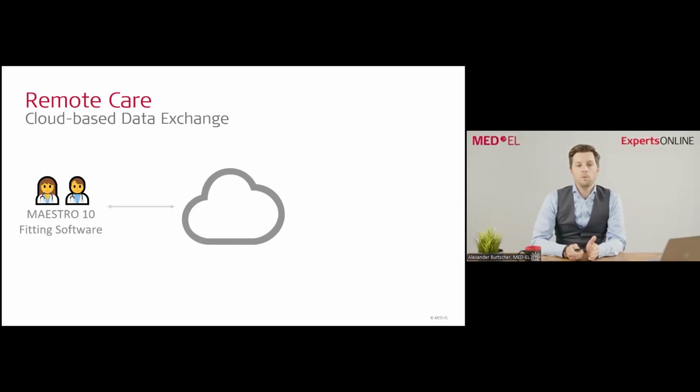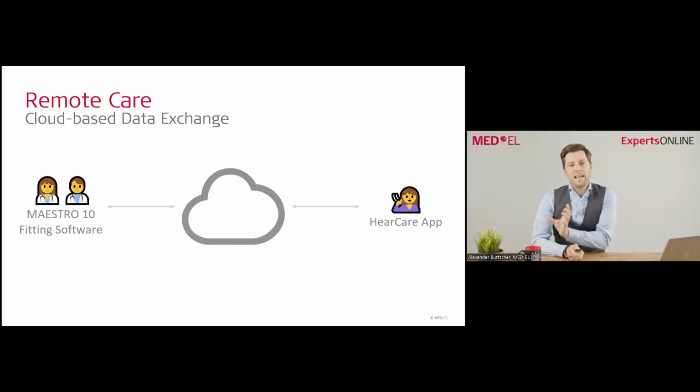But now we want to make it that there's the Maestro 10 fitting software where the clinician can work, of course, from the data that he or she knows of and has the whole patient record of the MED-EL CI user in there, but also that the patient has an app where they can perform certain tasks, certain remote care tasks that can help in facilitate this remote care data exchange.